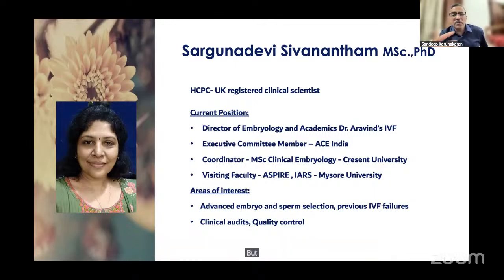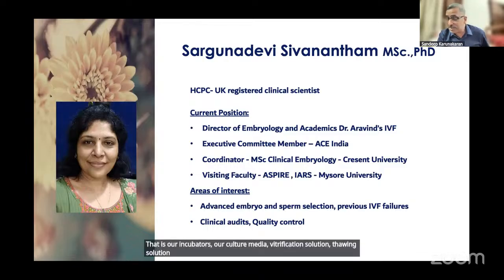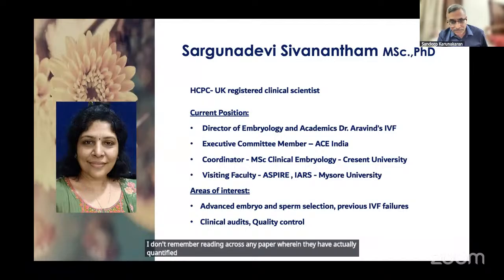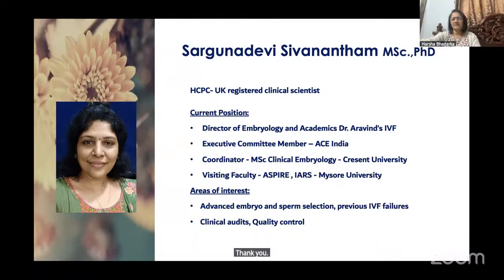But we all know that the more time the embryo is exposed to an alien environment, that is our incubators, our culture media, vitrification solution, thawing solution, again vitrification solution, and again thawing solution, there are definitely increased chances of epigenetic changes. I don't remember reading any paper wherein they have actually quantified this change. Thank you, sir. So thank you so much, sir.